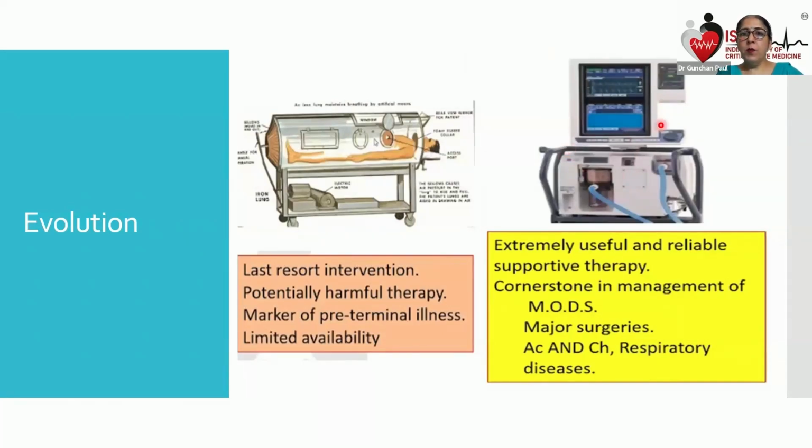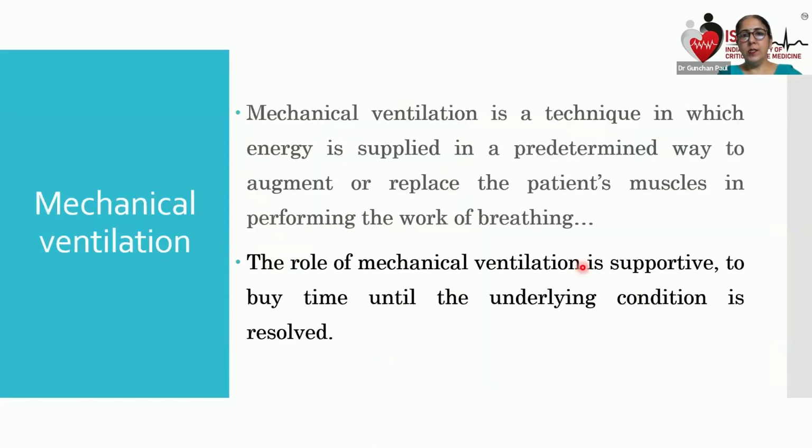That is the beauty of these ventilators, because any change which occurs during ventilation triggers alarms and a change in the graphics. So you come to know whether whatever you want to deliver is being delivered or not. They are extremely useful. But remember, mechanical ventilation is a supportive mode of therapy. It is not a treatment for something. Major surgeries are nowadays possible because of ventilation, and also it helps in acute and chronic respiratory disease. It gives you time till the basic pathology heals.